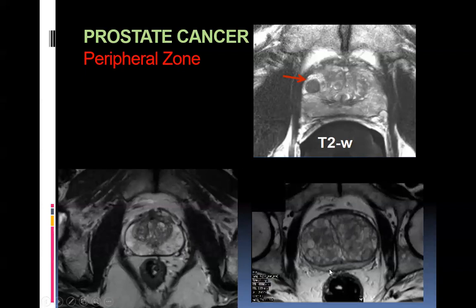Okay, here you see the peripheral zone is sort of stretched out. Why? Because the transitional zone is taking up the majority of the volume. So this is a BPH. Why? Because the peripheral zone is all stretched out at the periphery because of the growth of more tissue inside the transitional zone. There's another zone sometimes, if you want to know, this is known as the anterior fibromuscular stroma. So you can also have some tumors developing in the anterior fibromuscular stroma.